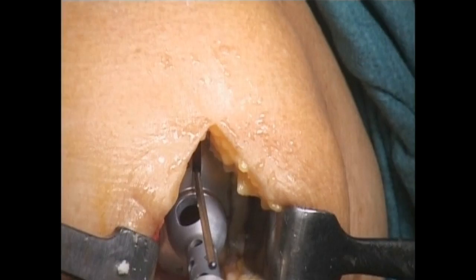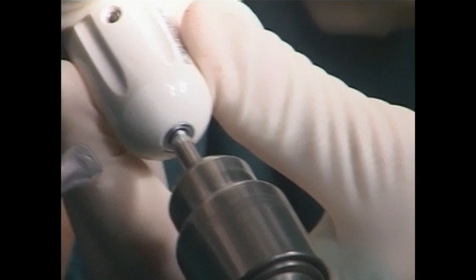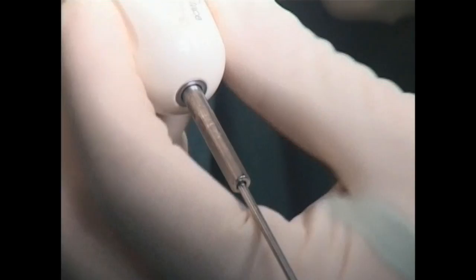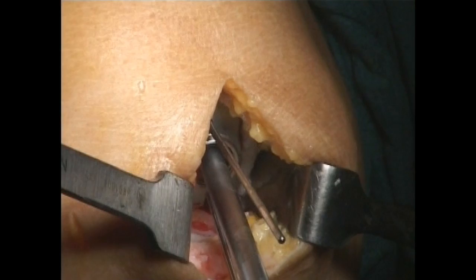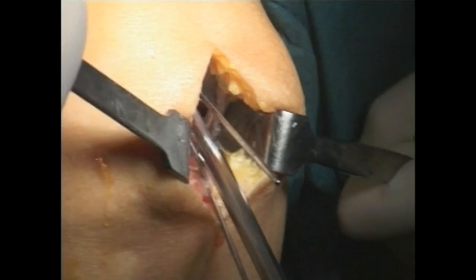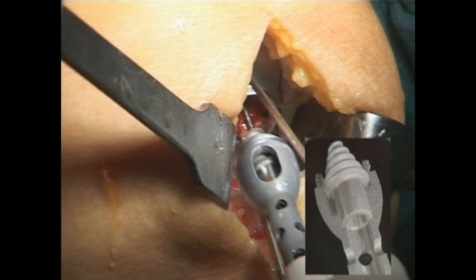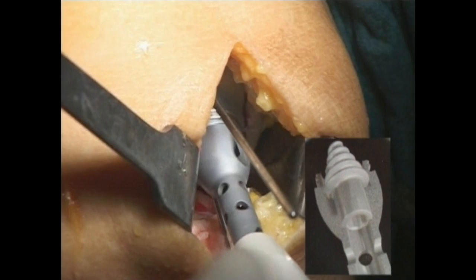The appropriate femur sizing trial attached to the sizing trial handle is then placed into position. With the femur trial still in the correct position, advance the femur pilot drill through the sizing trial handle and leave in place. Remove the handle and advance the femur step drill over the femur pilot drill. The tap is introduced and advanced on the femur pilot drill. The tap and the femur pilot drill are then removed.